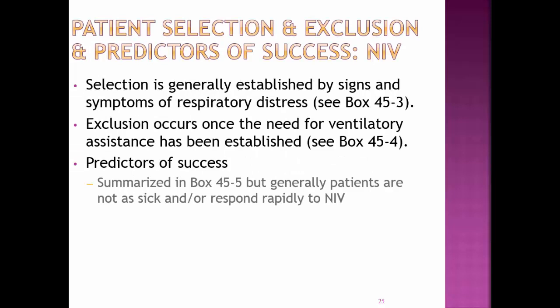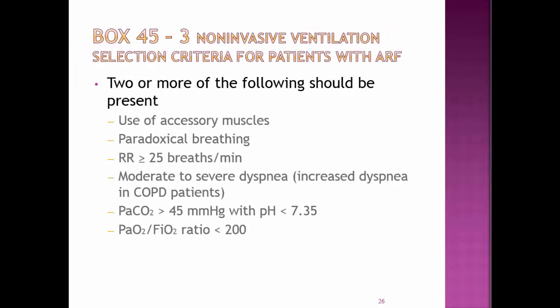Patient selection and exclusion and predictors of success for non-invasive. Selection is generally established by signs and symptoms of respiratory distress. This is box 45-3 on page 1140.